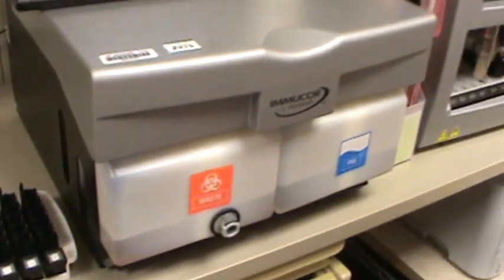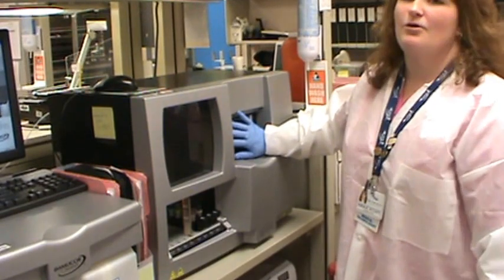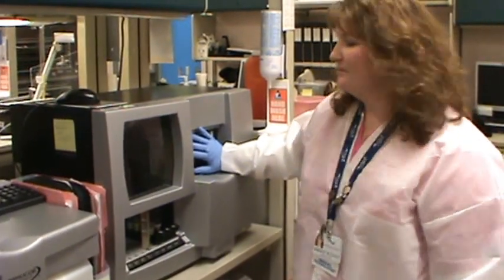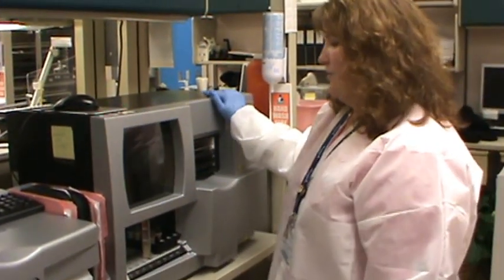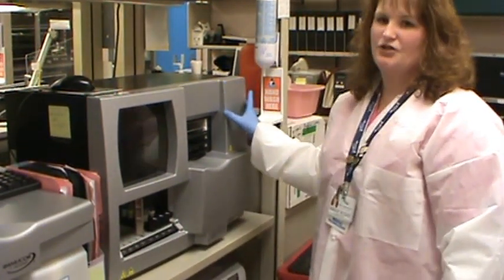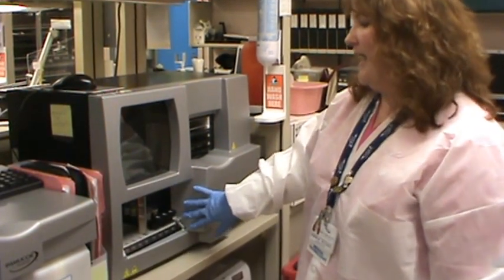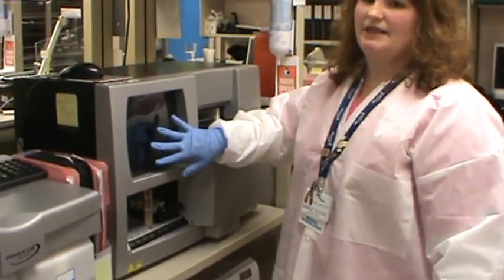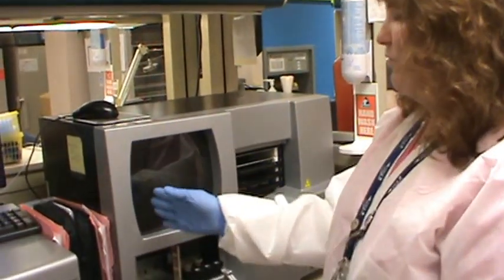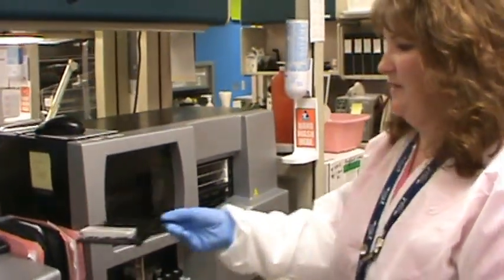To run assays, let's get back to the instrument module. On the instrument module, you also have your microwell strip loading bay. It also acts as your ambient temperature incubator. Inside the instrument, you have your centrifuge, which is located down here, and you have your 37-degree incubators. You also have your washer manifold and a mechanism that moves the strip wells from one station to the next. To load samples on the instrument, I will demonstrate now.